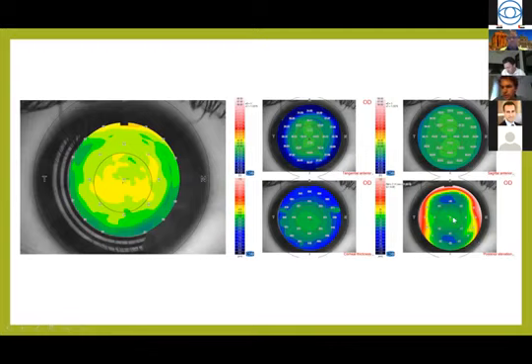It's true that I agree the posterior elevation has some subtle changes, but if I only saw this and the other eye was normal, I would do a LASIK here. But then I saw the epithelial map, and it was already demonstrating some focal thinning in the inferior sector of the cornea. So is this normal, or just an artifact of the epithelial thickness map?